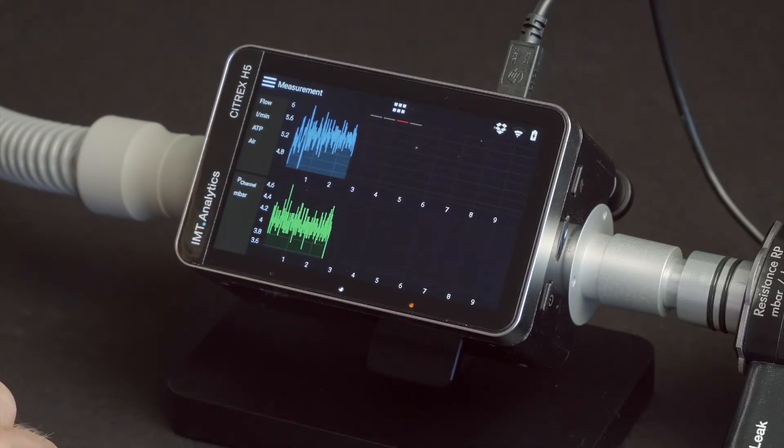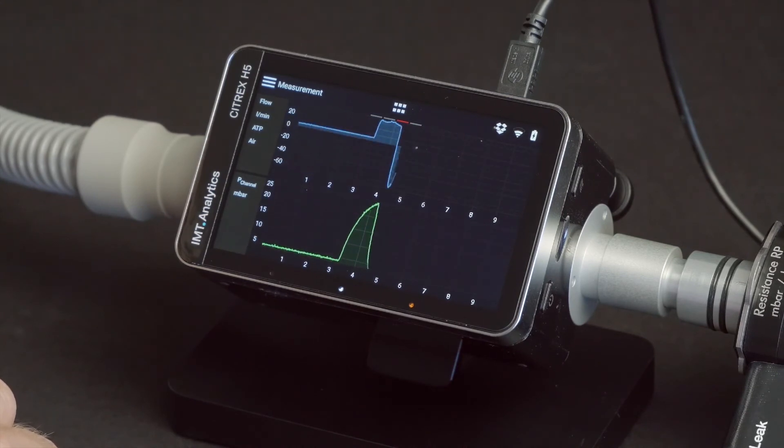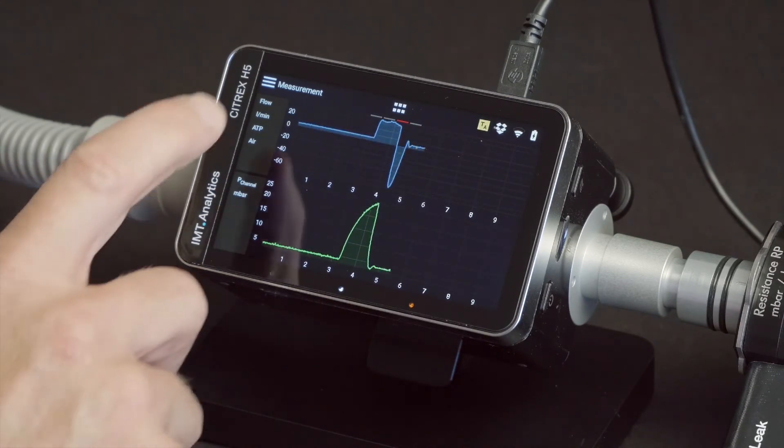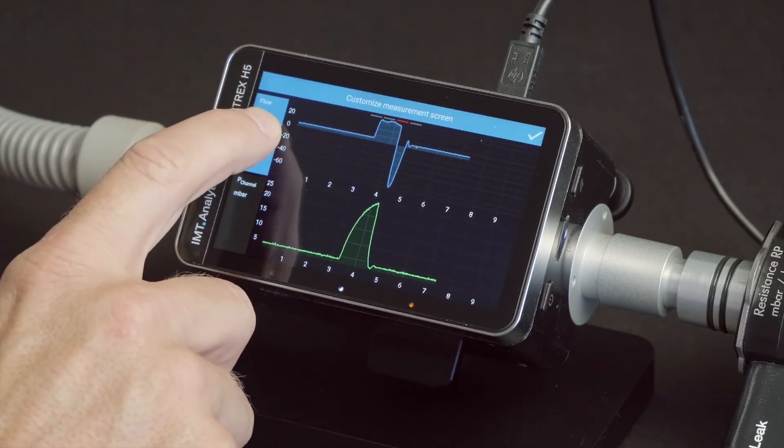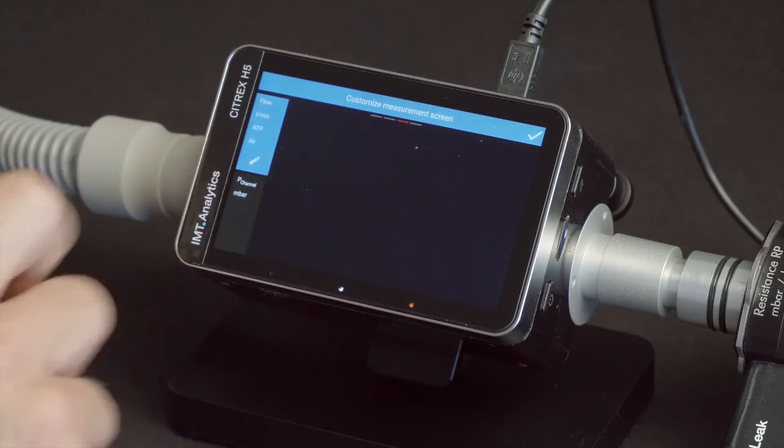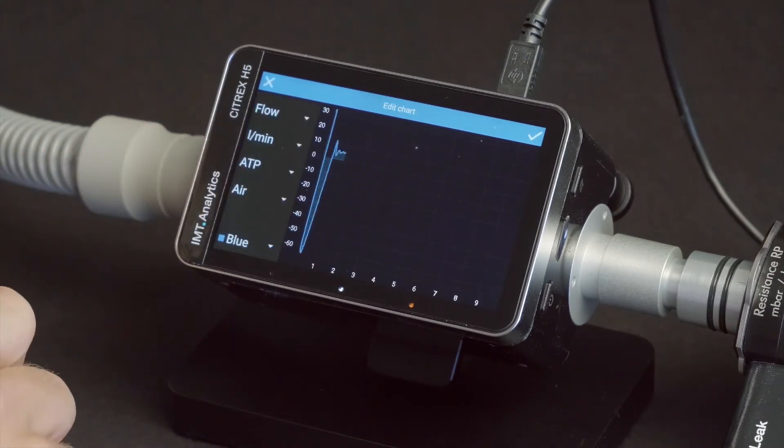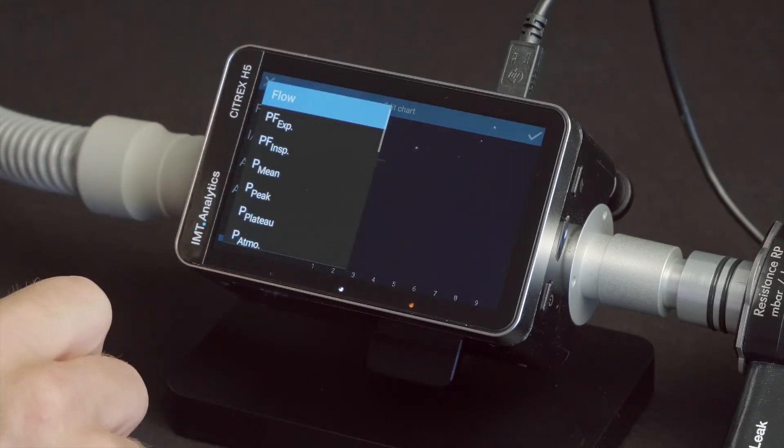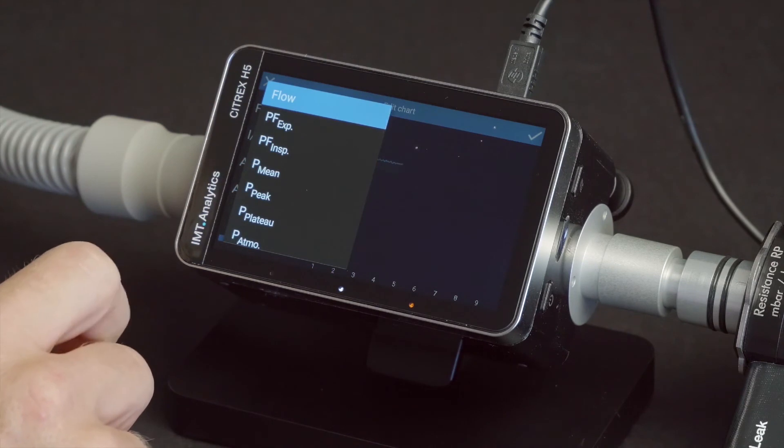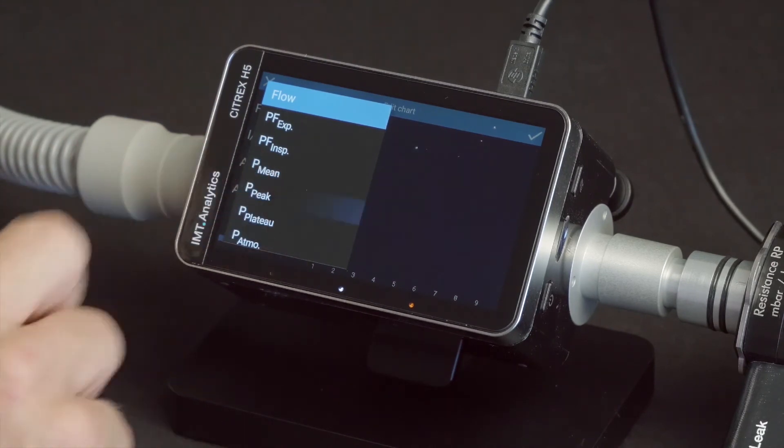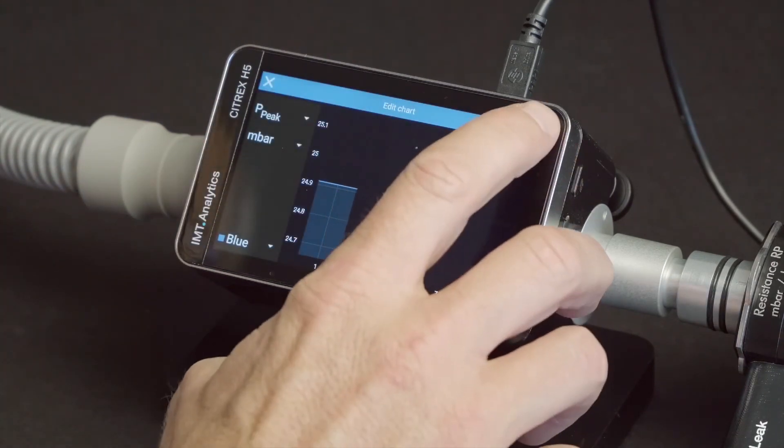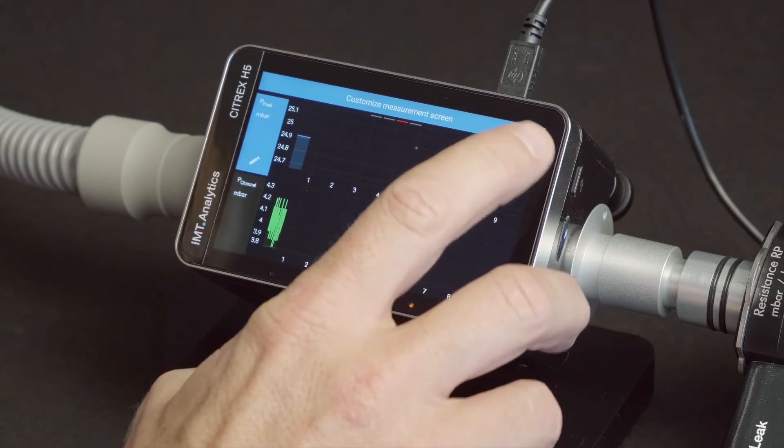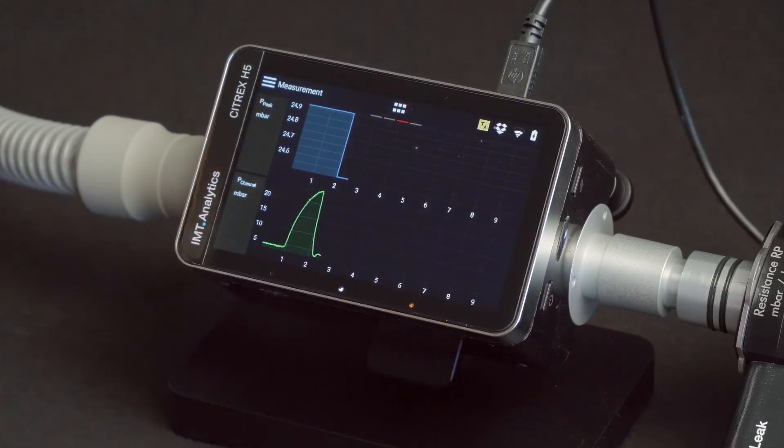You can change the values easily by tapping the name of the reading. In the full screen view, press and keep pressed for one second the left information bar. Push the edit icon. You have the option of changing the parameter, the unit of measurement, the gas standard, the gas type and the color.